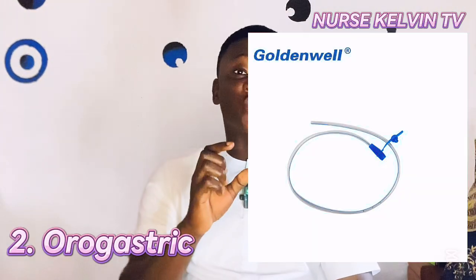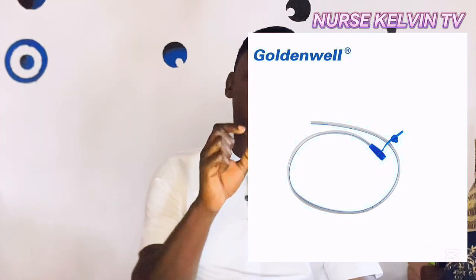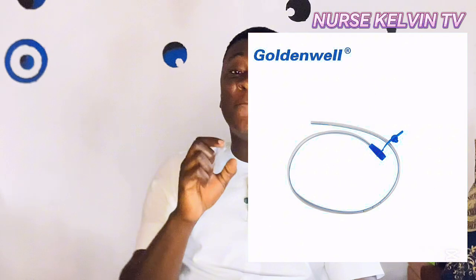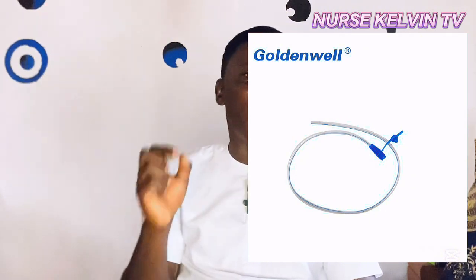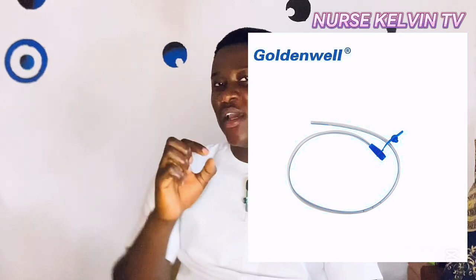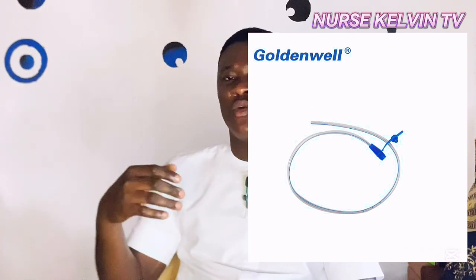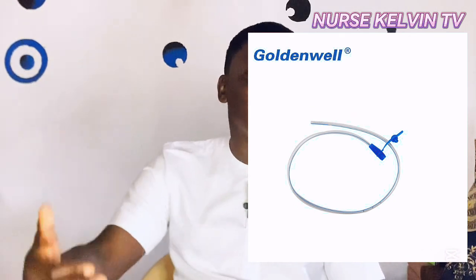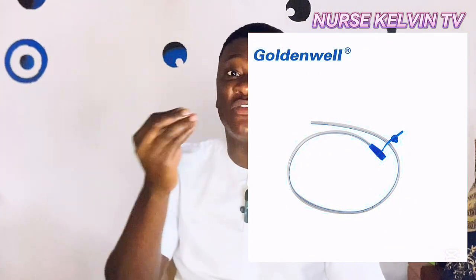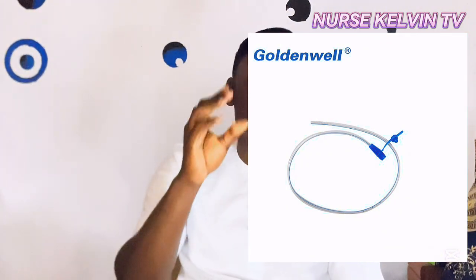The next one that we are going to talk about is the orogastric tube. It's mostly known as the OG tube, and these tubes are used for neonatal patients or intubated patients, in the neonatal unit, with maybe some conditions when the infant, the little one, cannot breastfeed or cannot tolerate breastfeeding.